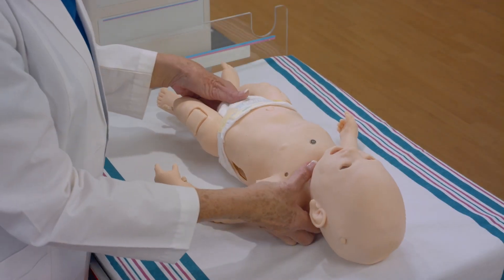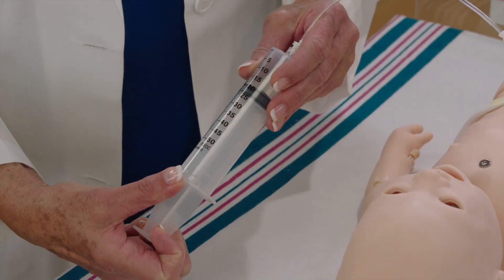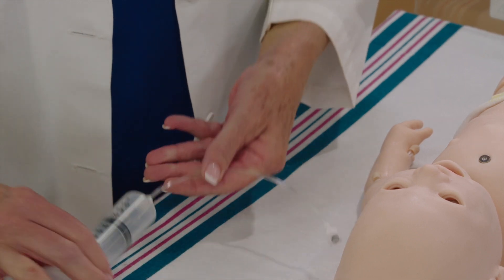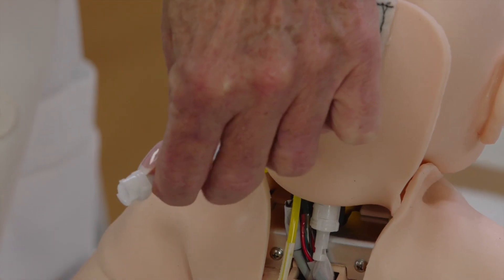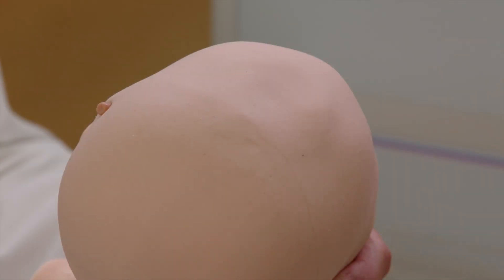Luna has an anterior fontanelle that can be manually activated. To enlarge the fontanelle, pull back on the syringe plunger to have 20 milliliters of air in the syringe. Attach the syringe and tubing to the fontanelle port on the back of the mannequin's neck, then inject air for the desired bulging appearance.